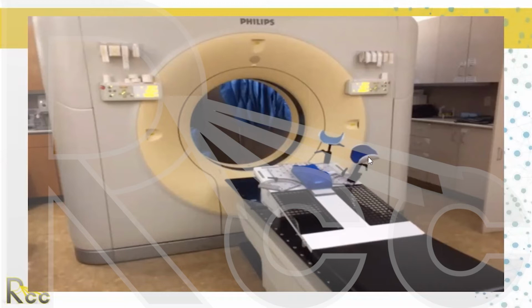This is a breastboard for treating breast cancer. The patient's head would be here, and her arm would be up here. So her arm actually hooks around, and it's held by these 2 things. And we can treat the breast without having her arm in the way. And all of this can fit inside the CT scanner. And so she is imaged in exactly the position she's going to be treated in.